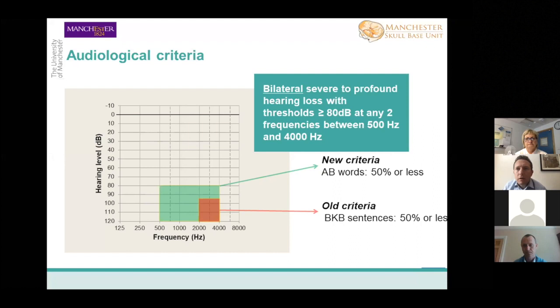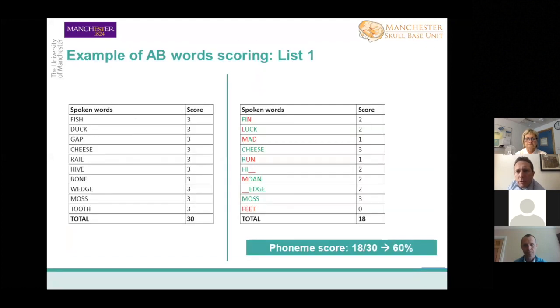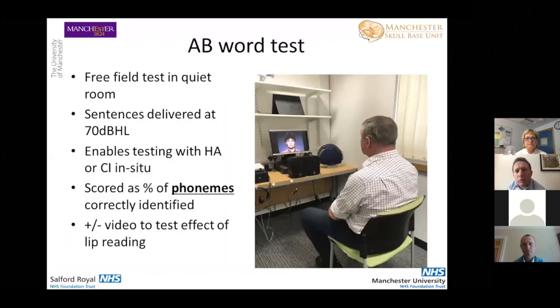So, Deborah, can you tell us a little bit more about what AB words are, what the word lists are, and how the testing's done? Yeah. So, as Simon mentioned, the AB word test is a monosyllabic word test. And we now use this test to determine candidacy for cochlear implantation in adults.